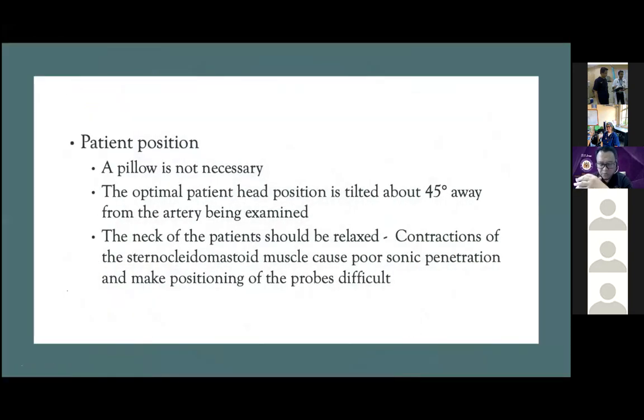Just now was the operator position. A pillow is not necessary. The optimal patient head position is tilted about 45 degrees away, so if possible, we tilt the patient's head 45 degrees to the opposite side. The neck of the patient should be relaxed. Contraction of the sternocleidomastoid muscle causes poor sonic penetration and makes positioning of the probe difficult. So it's very difficult to make sure the patient is a little bit relaxed, especially at the sternocleidomastoid muscle.